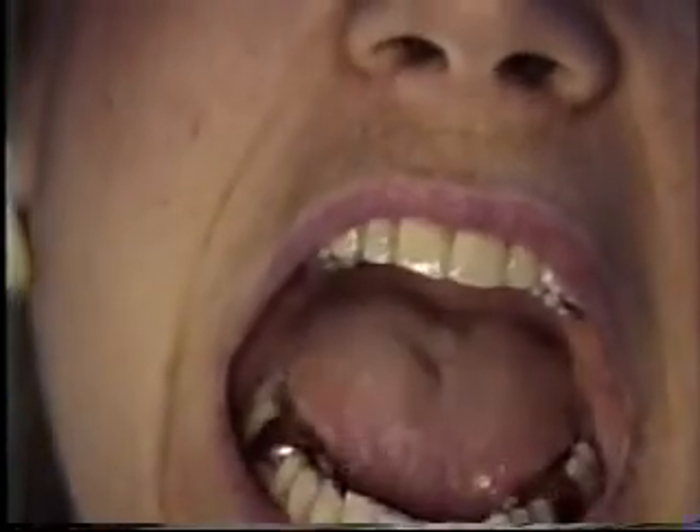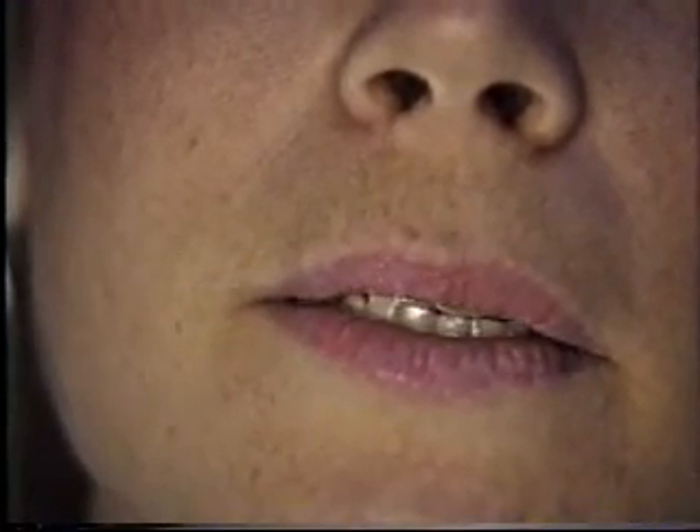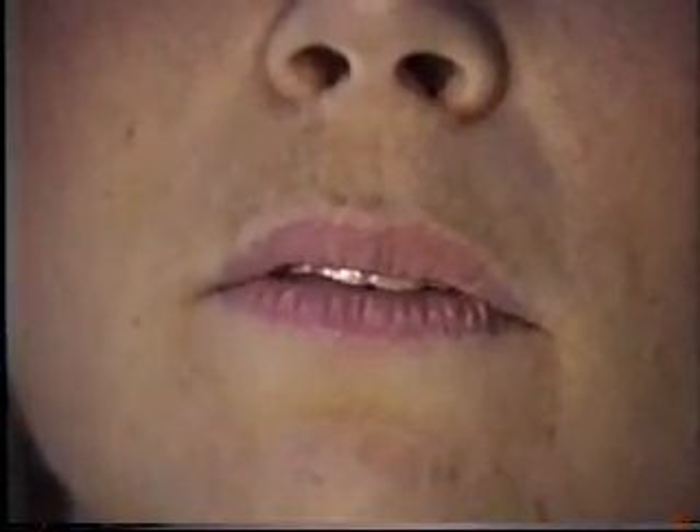Let's see, you've been wearing this bite splint now for about how long? Oh gee, six weeks? Mm-hmm, six weeks. So the last part was about a month ago, five, six weeks.